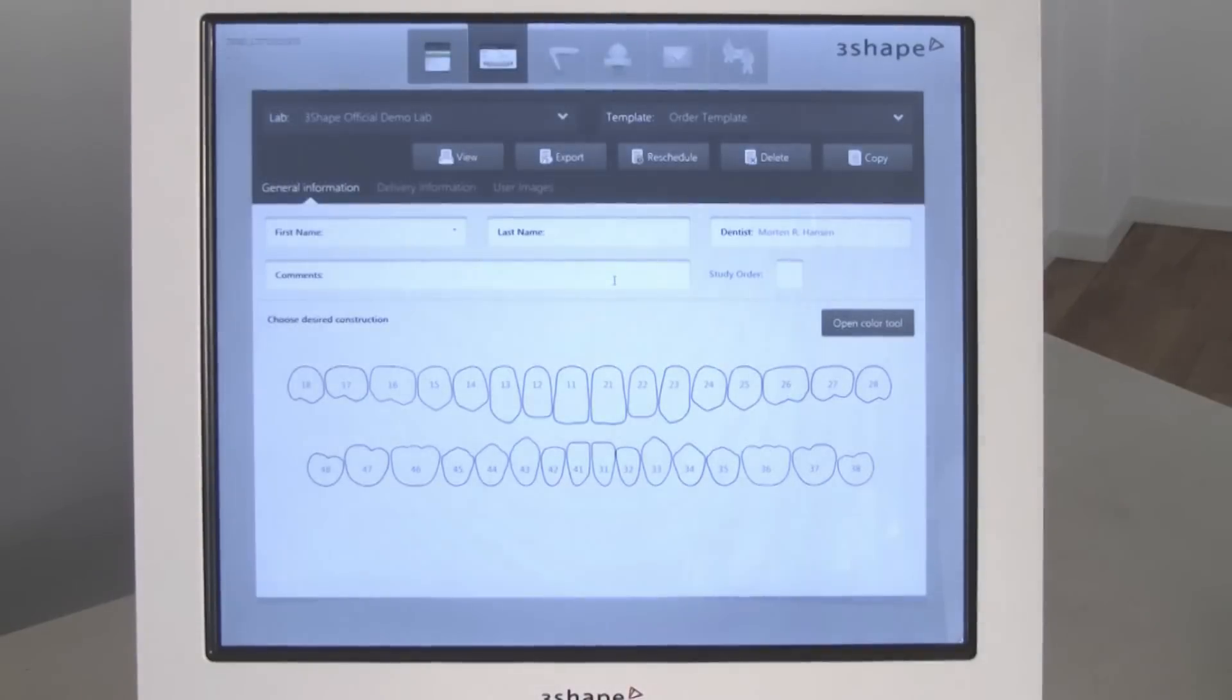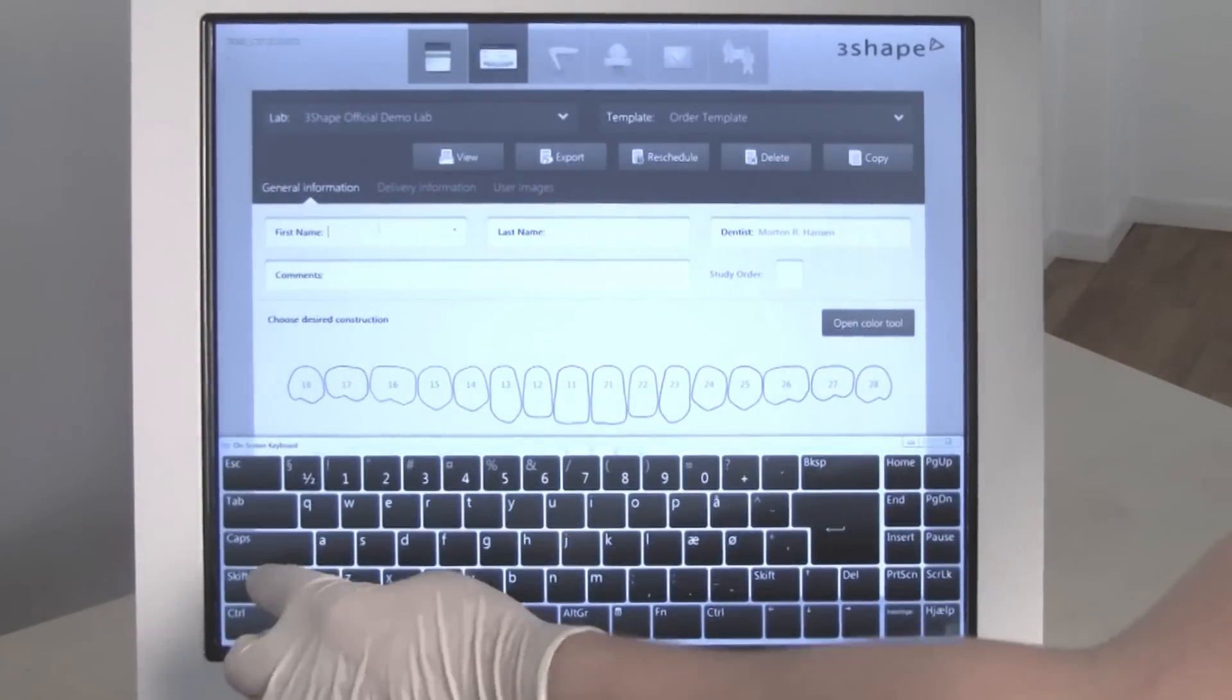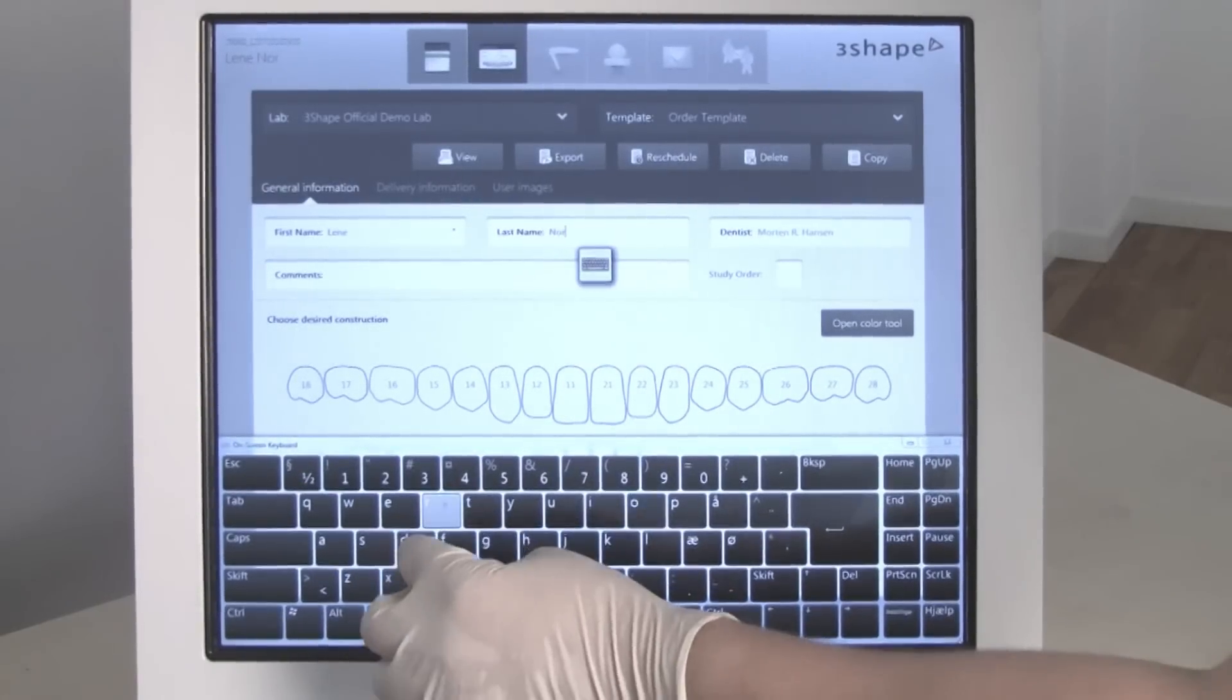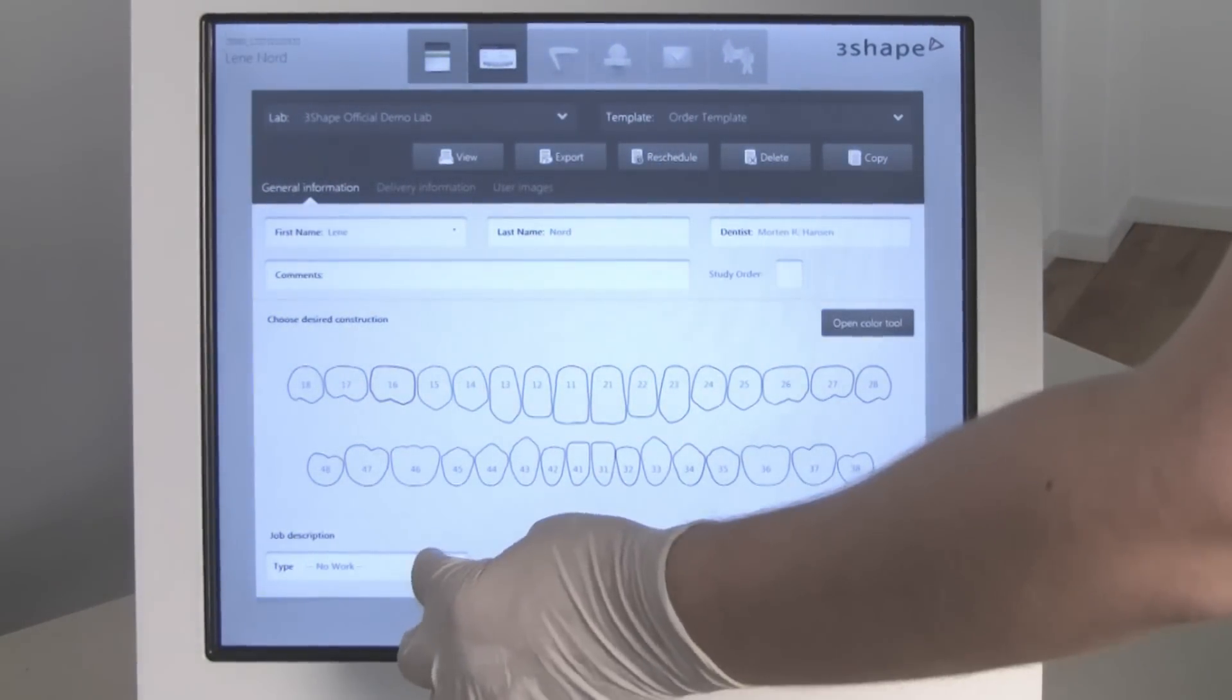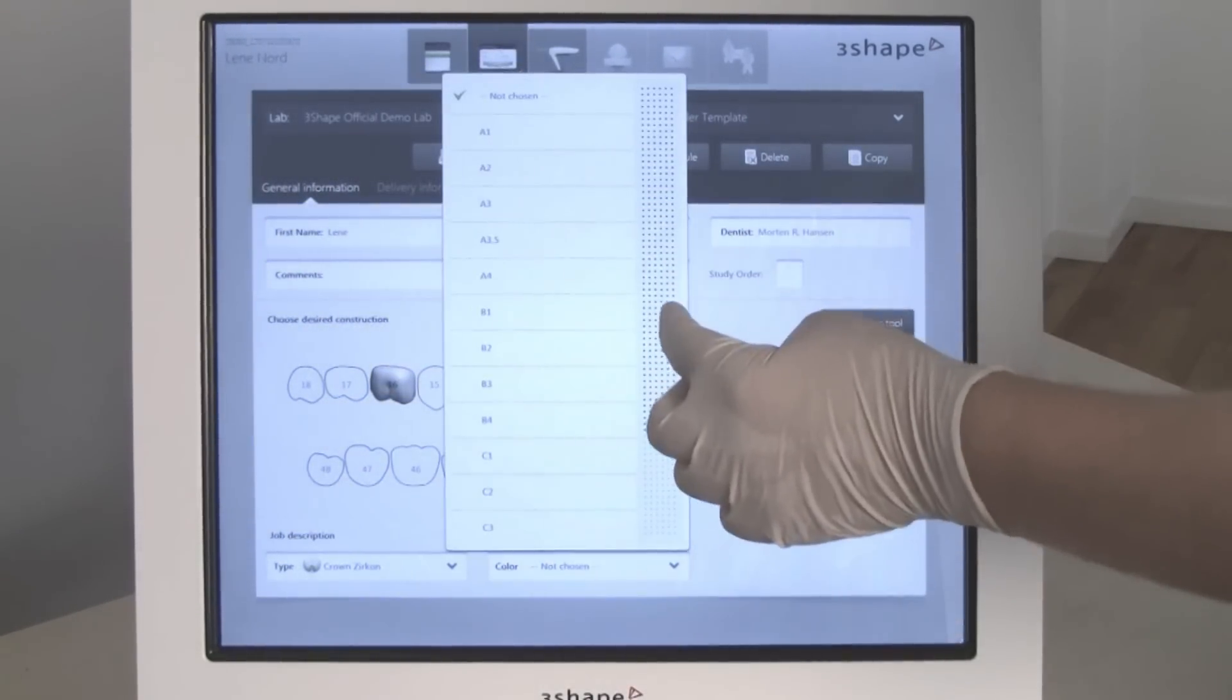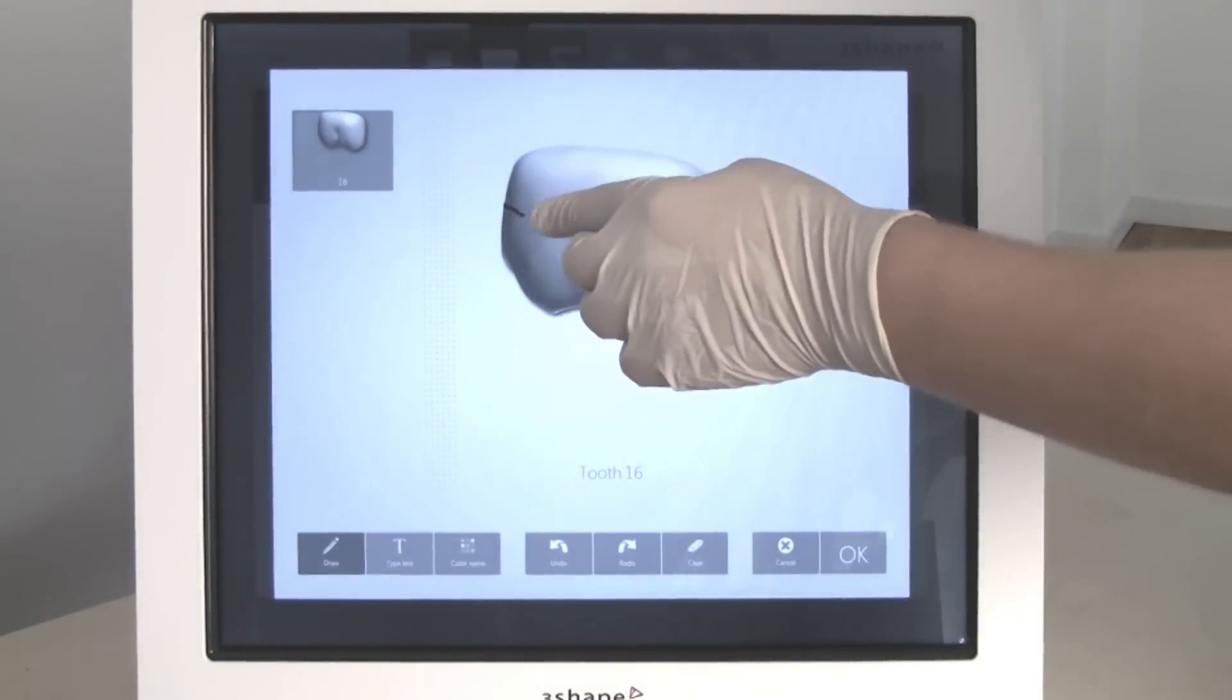Select the lab that will be used for the order. Enter the name of the patient. Select the restoration tooth. Select material from the drop-down list. You have the option to select the color for the restoration, or you can open the color tool and define exactly where multiple colors should be placed.